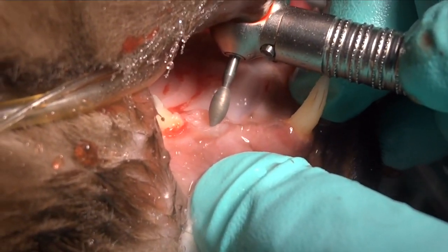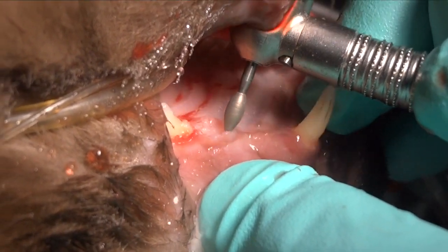We want to make sure that's nice and smooth. Once it's smooth we can come back and radiograph that.